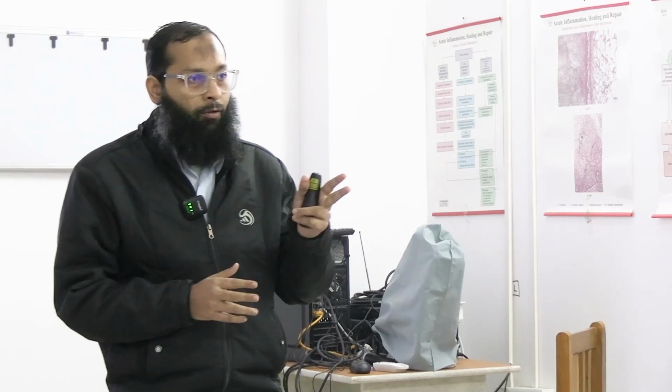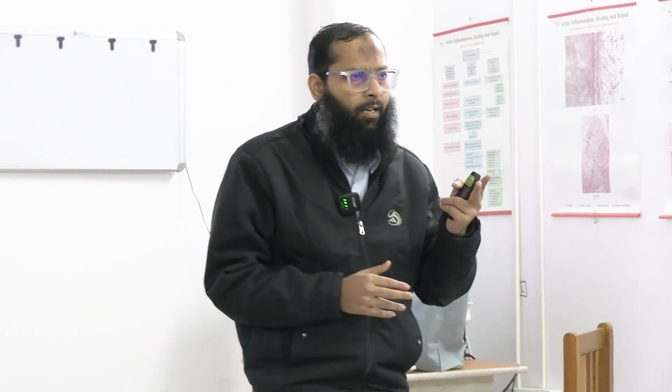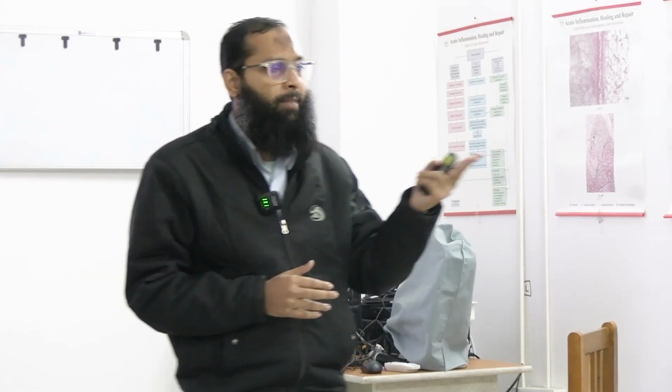What is the content of Leishman stain? What you told me, we can collectively call it Leishman powder, which contains both these two stains. That is the Leishman dye or Leishman powder, you can say.